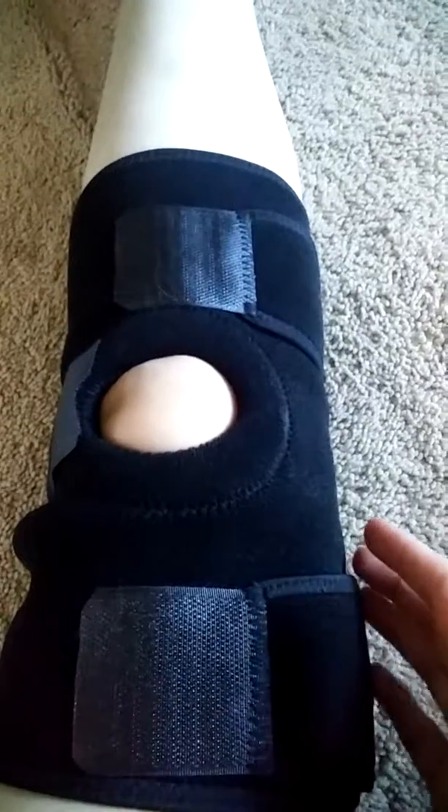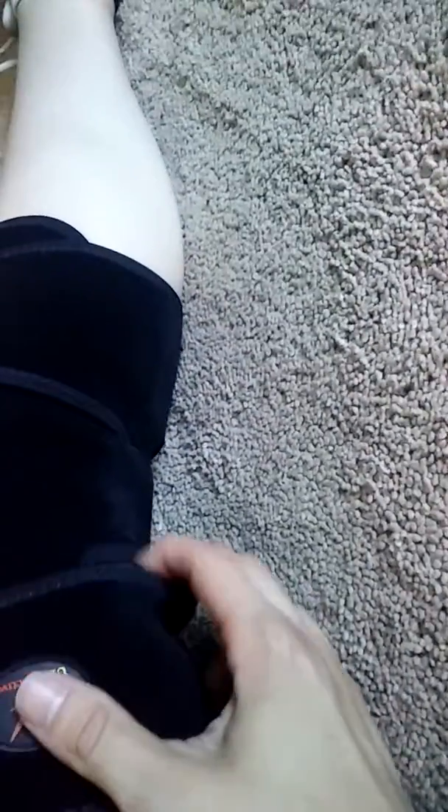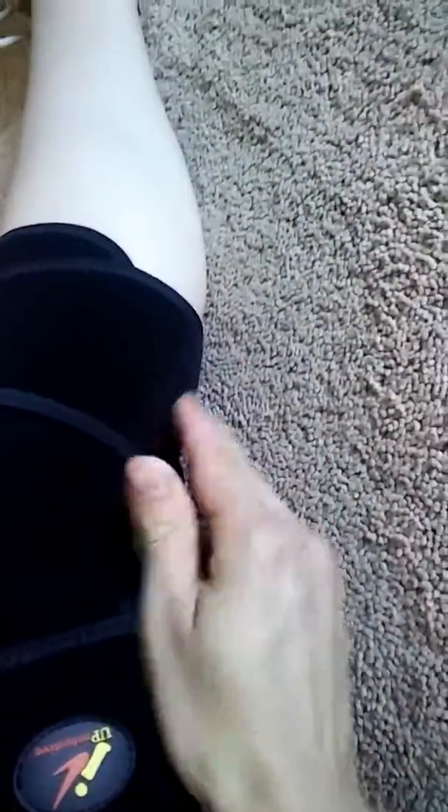Once you get used to putting it on, it's pretty easy. You do have to get it adjusted correctly for it to go on right. This is what it looks like in the back — there is a little bit of air space, but you don't get great air circulation unless your leg is bigger.